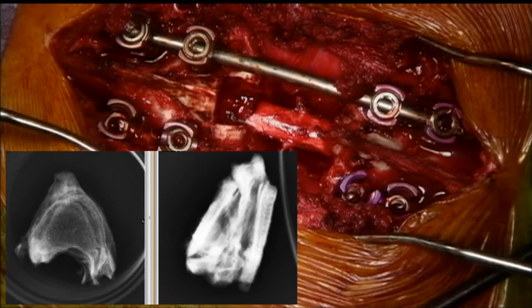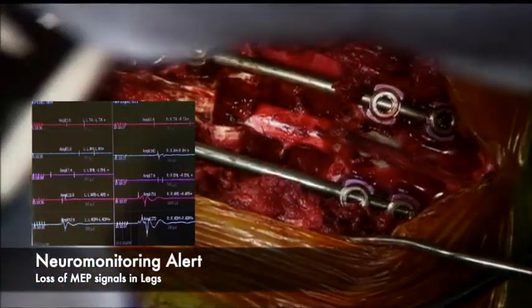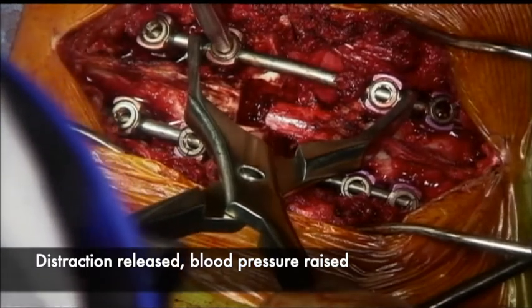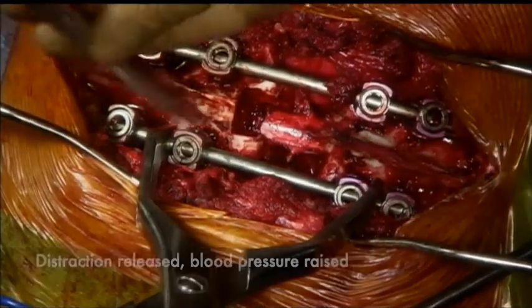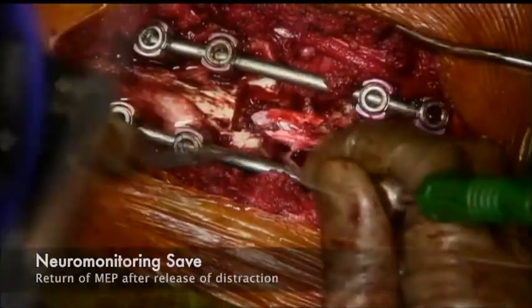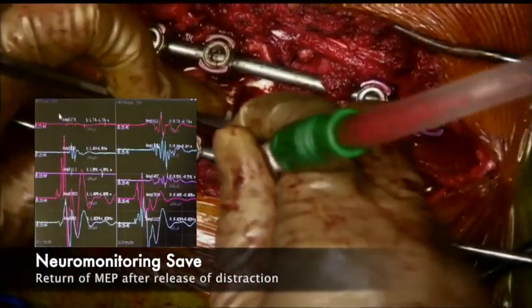This is the X-ray of the specimen showing complete en bloc resection. At this stage, there was a neuromonitoring alert with loss of MEP amplitudes in the legs. The distraction across the screws was released and the blood pressure was raised. As we were preparing for the wake-up test, the MEP signals returned, and hence the wake-up test was cancelled and we proceeded with the surgery.